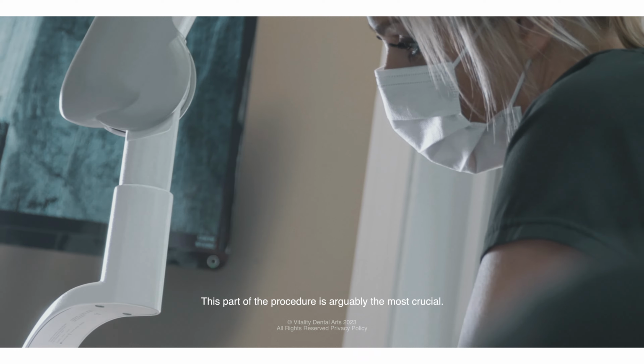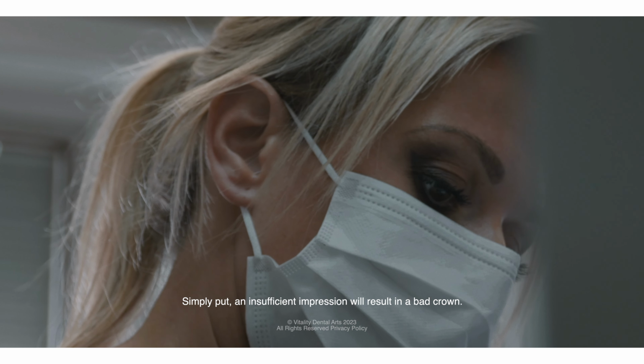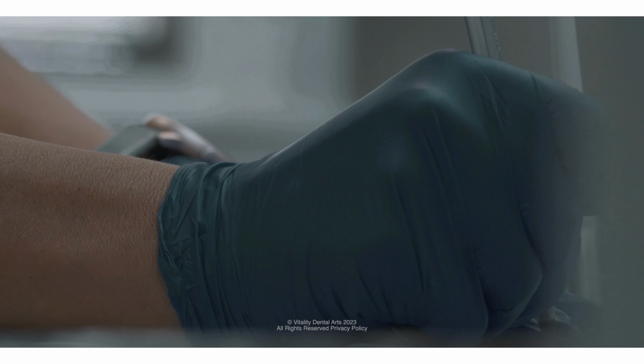This part of the procedure is arguably the most crucial. Simply put, an insufficient impression will result in a bad crown.